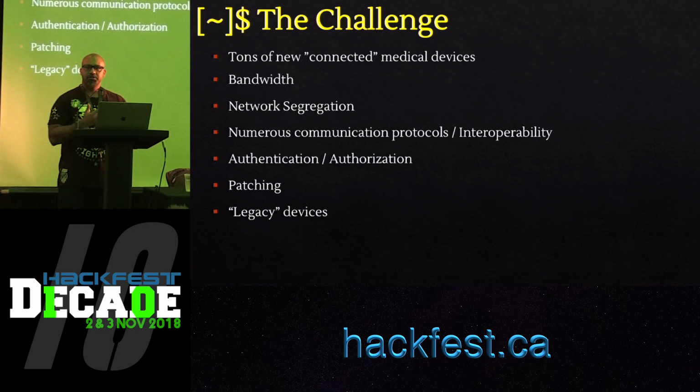Interoperability is going to be another issue because tons of devices, especially from different manufacturers, talk on different protocols. So to get them to talk to each other is also going to be a challenge. Authentication and authorization could be a big challenge because I think we are approaching a time where, and I think it's still happening in some of the medical institutions, patients can bring their own device in, which is connecting to the medical institution's network and then transferring data. So how do you differentiate between a legitimate device from a malicious device?